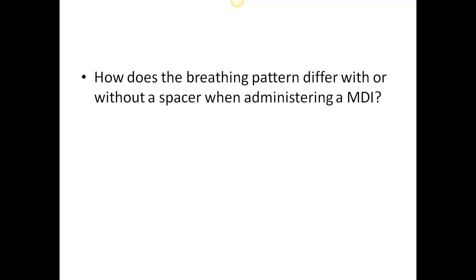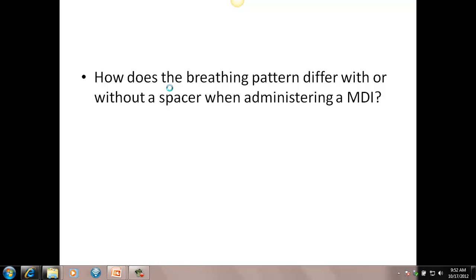With a spacer, we can also take several breaths to acquire the medication. Without a spacer, we activate the canister after the breath has begun. So we start to breathe in and then activate the medication. Again, slow, deep breath in, but we only have one breath to be able to get that medication.